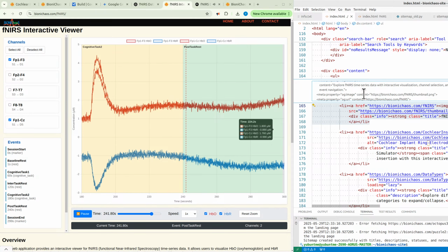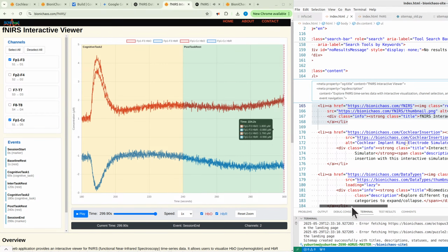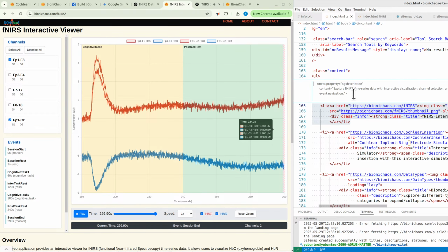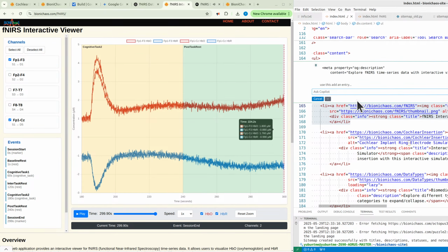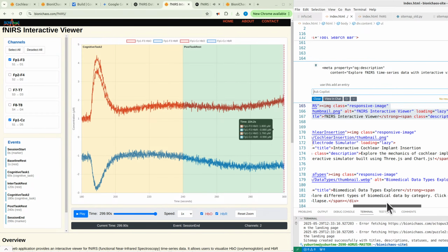Meaning each channel picks up activity from a slightly larger area, so you might see an averaged response. Exactly. Also, keep in mind the placement of these specific channels mentioned. FP1-F3, FP2-F4 are both on the prefrontal cortex, which has a lot of interconnected activity, especially during executive functions. Right. F7-T7 and F8-T8 are over frontal and temporal areas, often working together in cognitive tasks. And FP1-CZ is a more long-range connection, but could still show some correlated activity depending on the task.